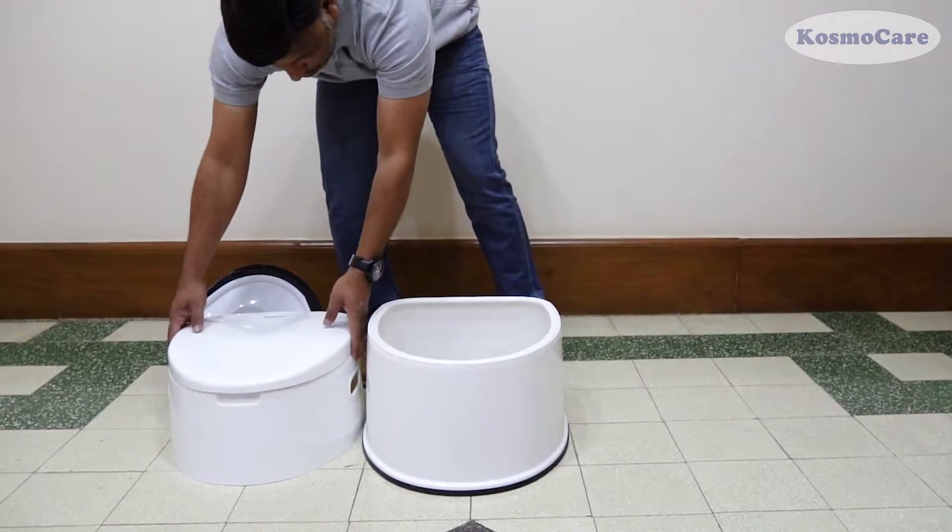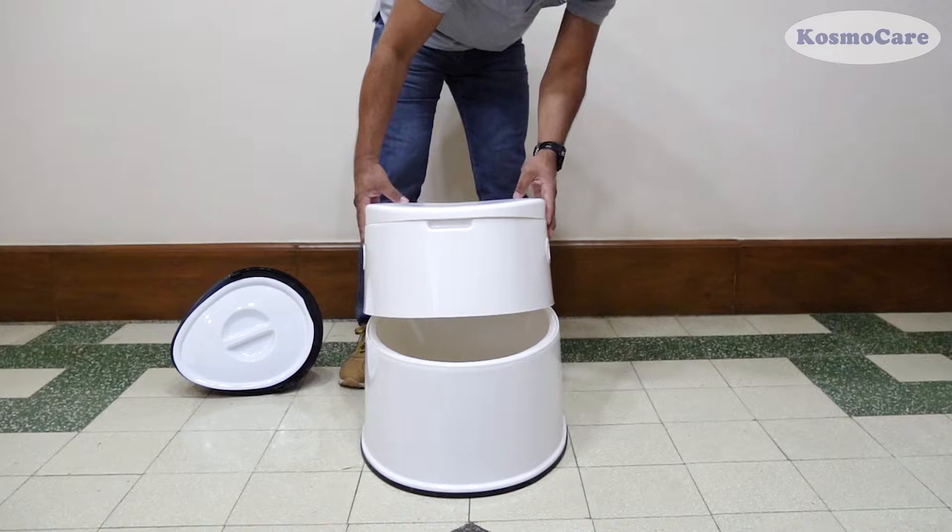To start with the assembly, place the upper section of the commode over the anti-skid commode base.